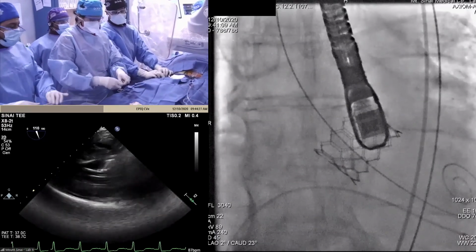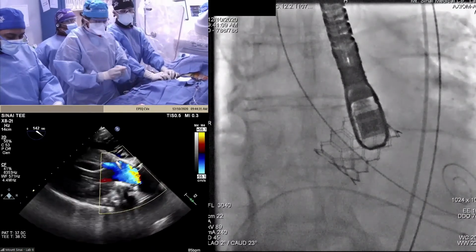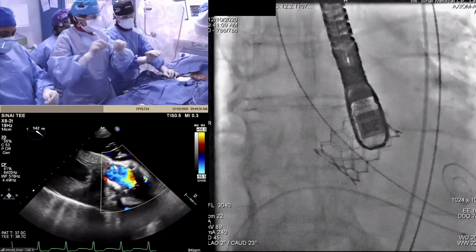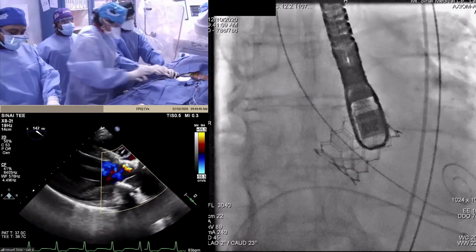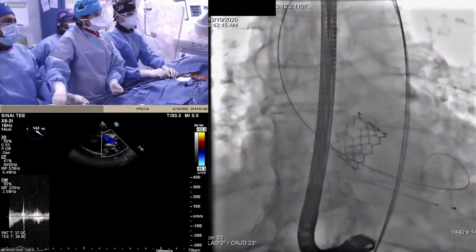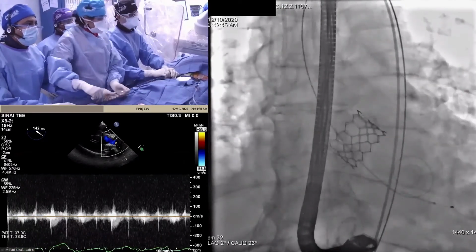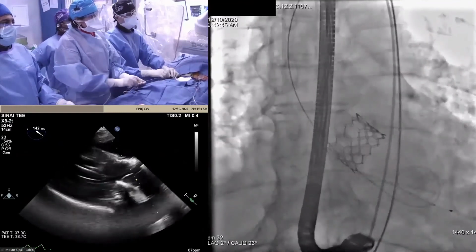I would say it's probably around, I don't know the exact number right offhand, but probably around mid-30s, or 35, 36, if you look at, let's say, a commissure distance. But I think the other thing that's different about this particular anatomy compared to other bicuspid anatomy, as you saw, is that there's really no supraannular calcium that might constrain the valve or make it a potentially better seal. So it's pretty benign leaf-like calcium overall.